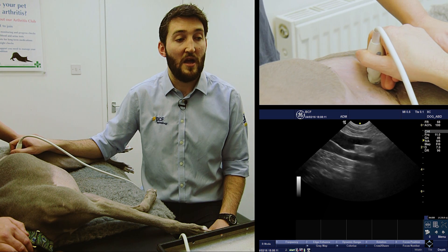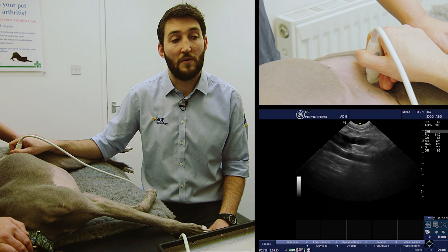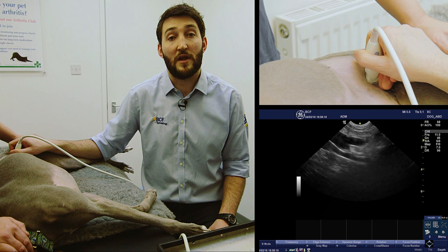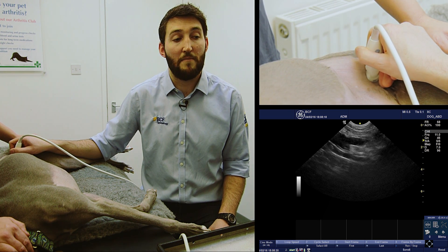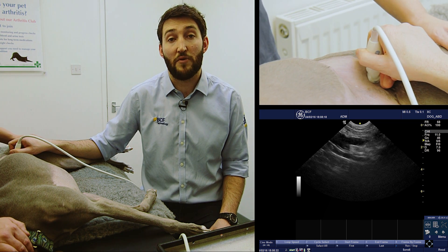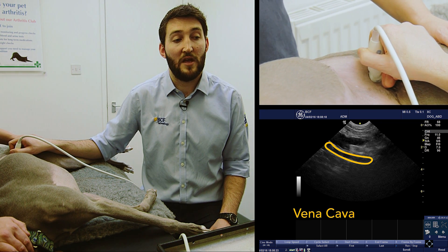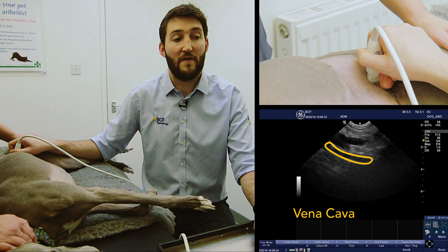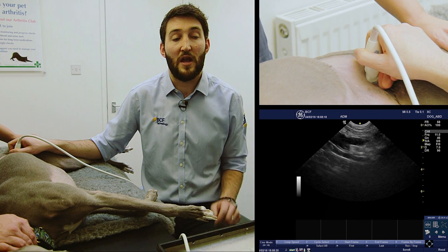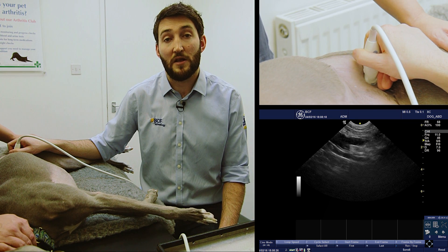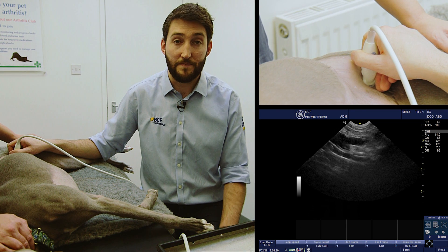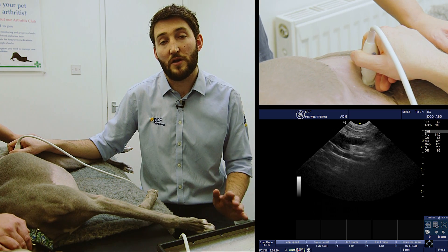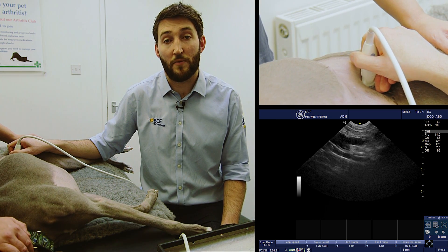Unfreezing the image again, we can see at the top of the screen the aorta forking into the external iliac arteries left and right, and then below that the vena cava, which is just being slightly compressed by the probe. If I freeze the screen there, we can just see a little bit of the right medial iliac lymph node appearing between the external iliac artery and the vena cava below it. To scan the right one, we can either turn the dog over or just look between those two vessels.